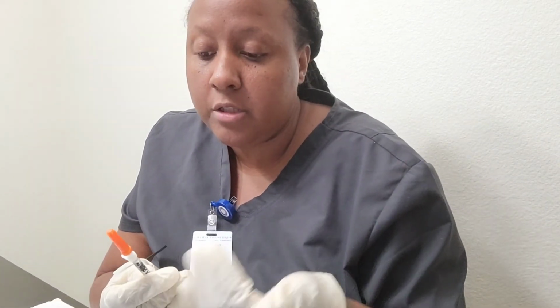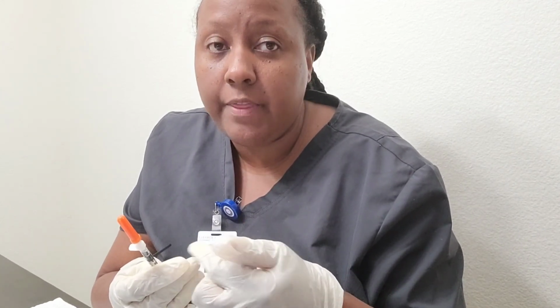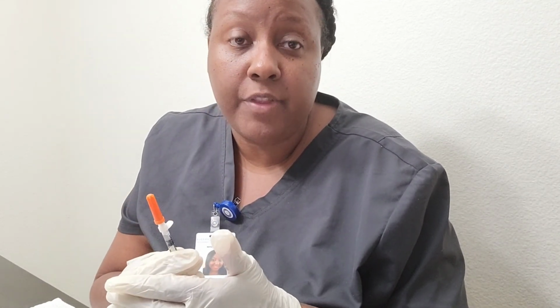Also, every time you pull back, make sure that you're verifying that you're getting 4 units of the regular insulin and 8 units of the intermediate insulin, the NPH. And then confirm that the total is exactly the dose, which is 12 units. Okay, so now it is ready to be administered.